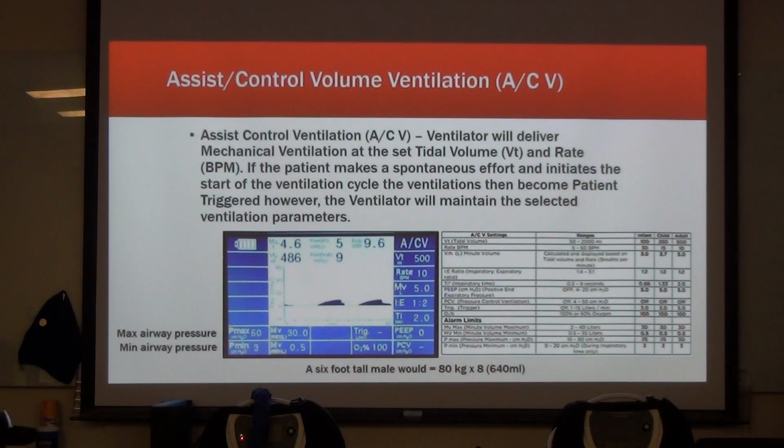Because it's going to sense trigger. The thing that I would look at is that your trigger is going to sense and then give that volume when they take an inspiration, like you just said. The thing is, if the volume's not enough and they still feel short in what they're taking in, you'll actually see that. Then you can make adjustments to increase volume.